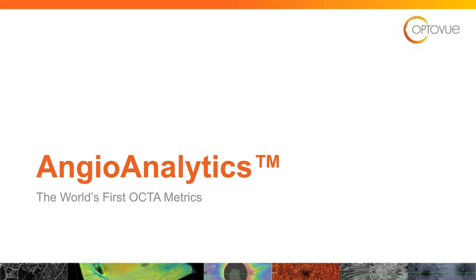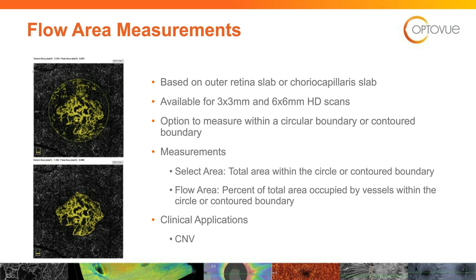And this is, again, the numbers behind the imaging of the blood flow. Give us some numbers. We all like numbers in our regular OCT. When managing glaucoma, looking at that retinal nerve fiber layer, looking at the individual quadrants, the sector analysis, ganglion cell analysis, we all look at those numbers, and we want numbers in OCT angiography as well, and that's the angioanalytics.